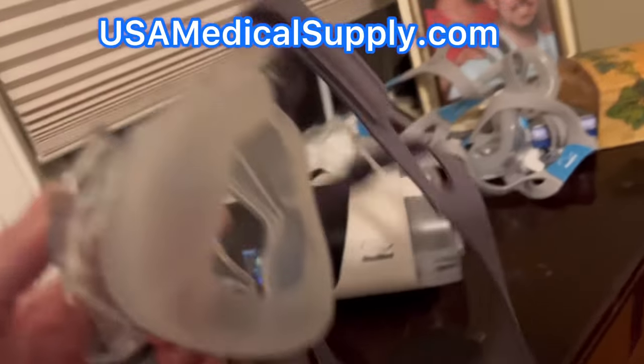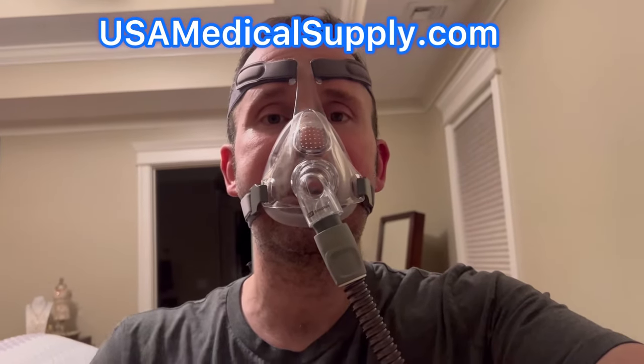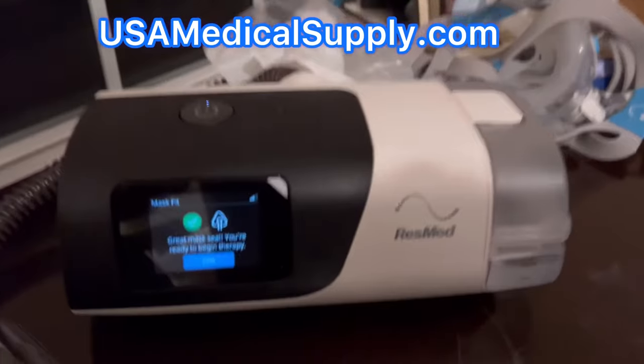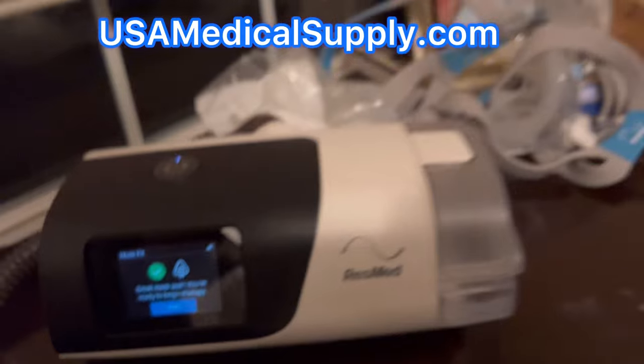Now I'm going to put this mask on. While I wear the mask, the machine is going to be blowing up to 20 centimeters of water pressure and allow me to make the necessary adjustments to my mask while telling me whether I have a good seal or a leak. It's showing I have a great seal.